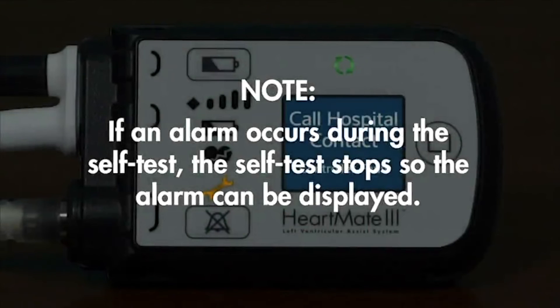Please note that if an alarm occurs during the self-test, the self-test stops so the alarm can be displayed.